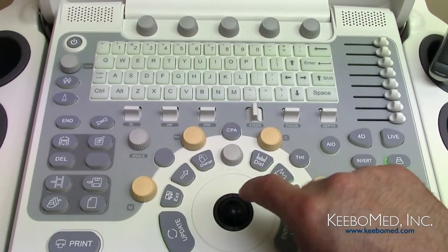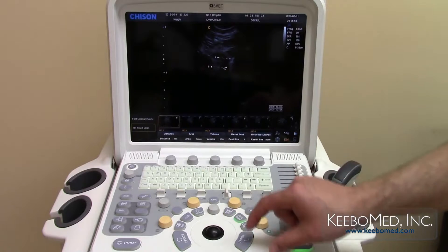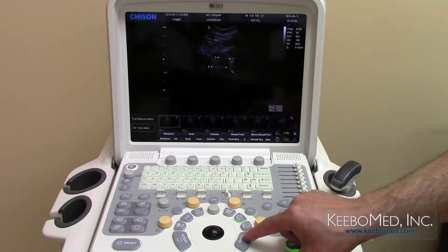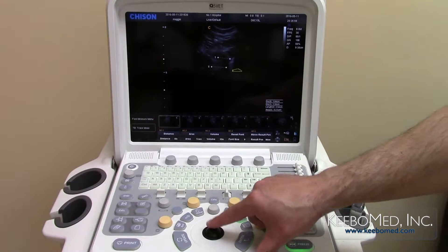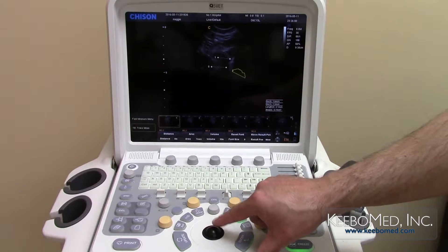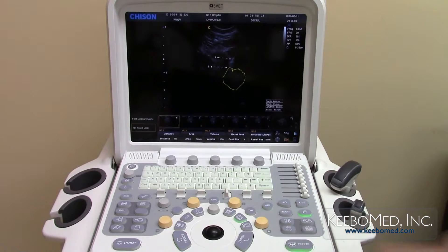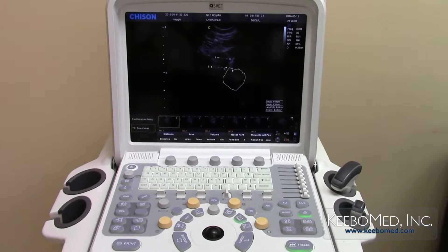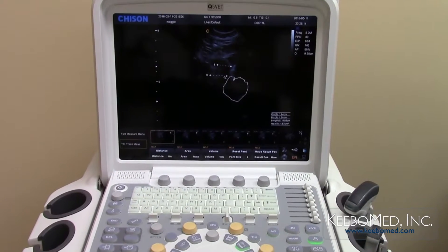Use the trace function to select the desired area to measure. Press enter to select the starting point, move the trackball until the desired area is selected, then press enter again to confirm the selected area. The results are shown on the bottom right of the screen.